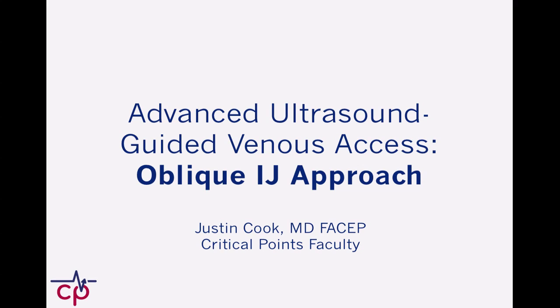Justin Cook again with the Critical Points Crew, and I want to talk about some more ultrasound stuff in a more advanced realm — this being the oblique IJ approach, which I'm really having a lot of fun with lately. I've taught this to residents a number of times and they seem to pick it up pretty quickly. I think what it has to offer is some pretty cool safety advances.